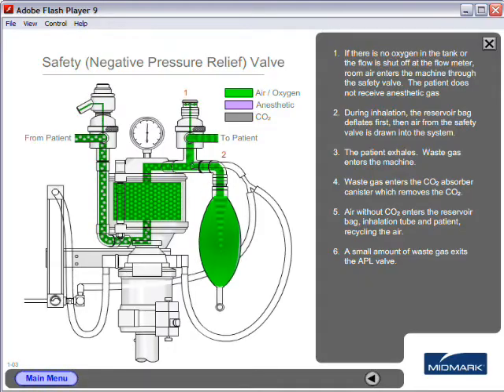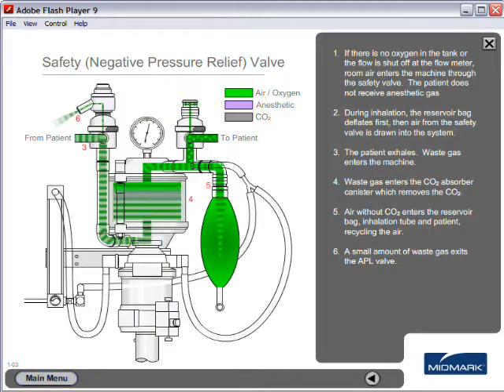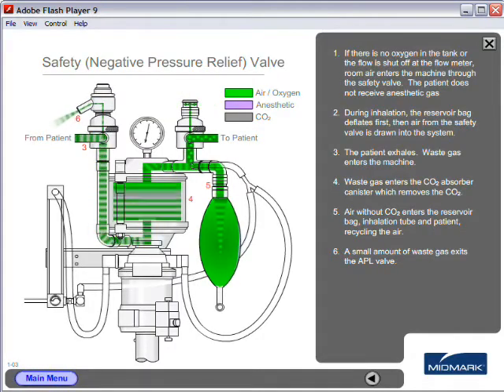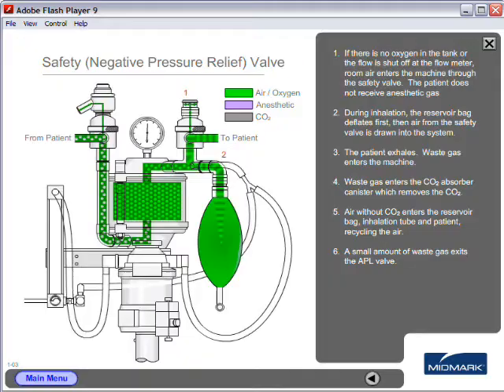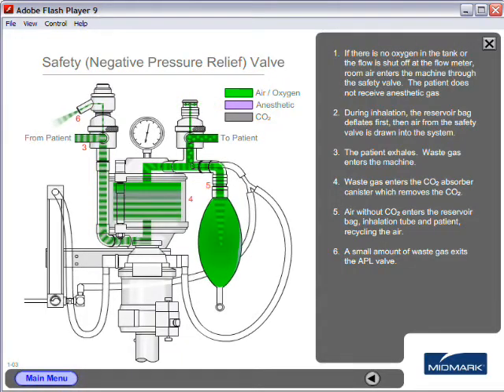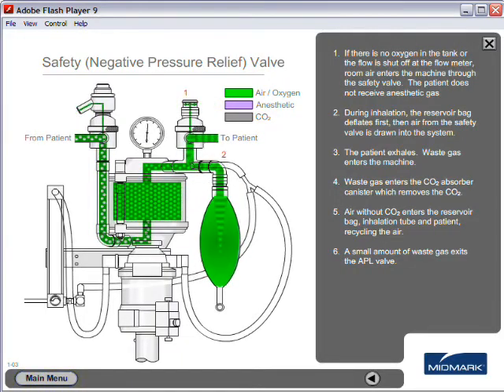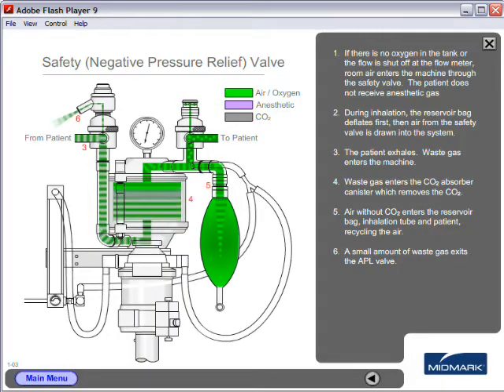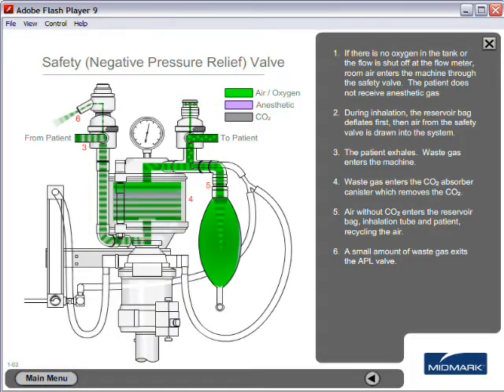The patient exhales and waste gas enters the machine. Waste gas enters the CO2 absorber canister which removes the CO2.